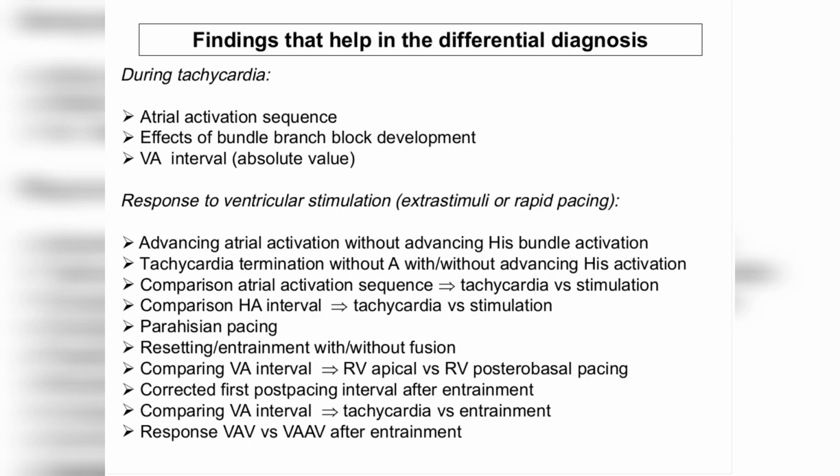As was said before, we cannot go over all these maneuvers, so we have selected some of them that we feel are particularly interesting. For each of these maneuvers, we will show you one slide first that describes the intellectual content and how to do it, and then we will provide some examples, because we want this to be a very practical webinar.